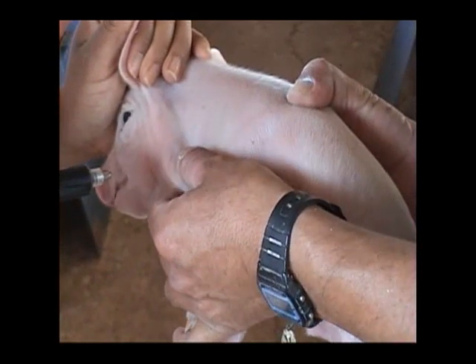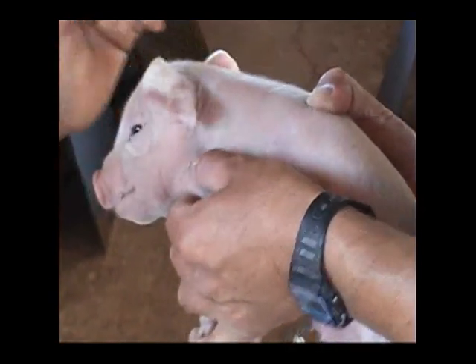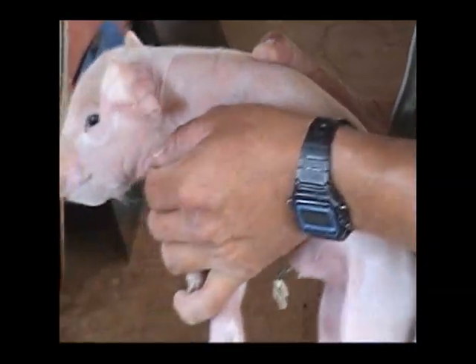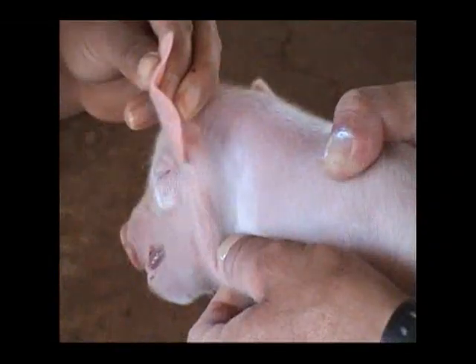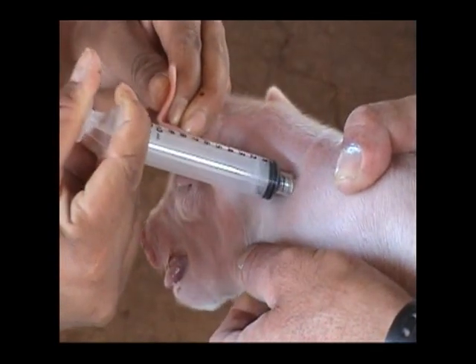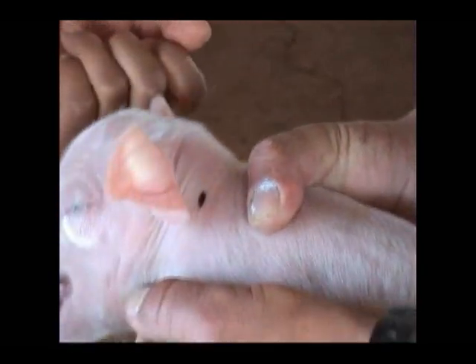Veámoslo nuevamente, en otro lechón. Se jala la piel, se introduce la aguja, se inyecta, y vean, no hay nada de derrame. Excelente. No confundir cuando la aguja lleva una gota en la punta, como vemos ahí, no se está derramando. Es solo la gota que llevaba la aguja en la punta, la que quedó fuera de la piel.